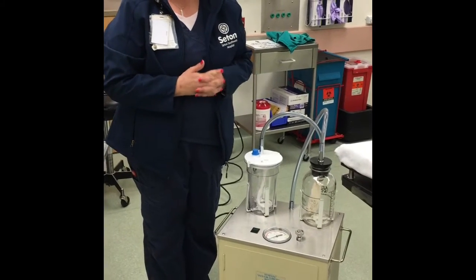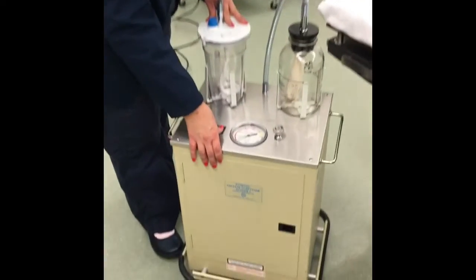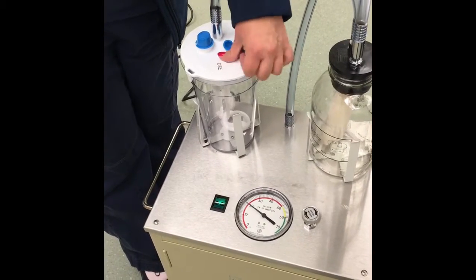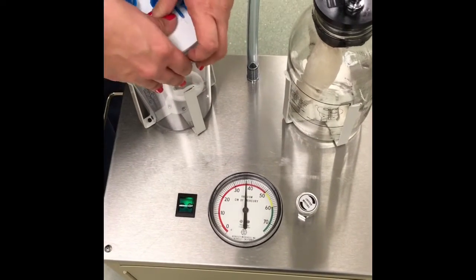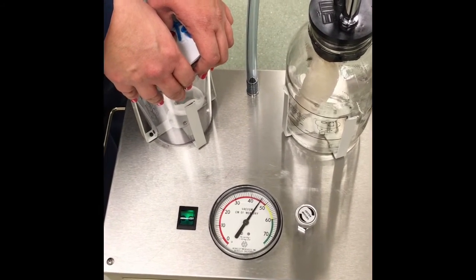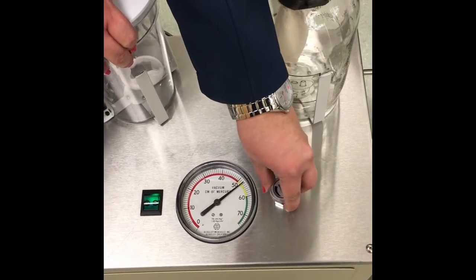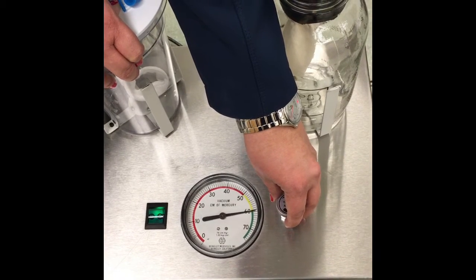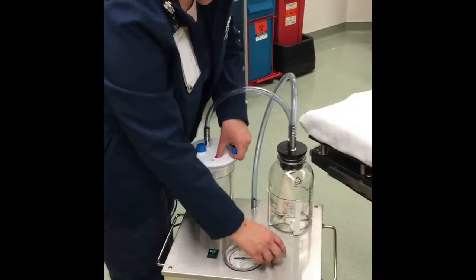The only thing you have to do during the procedure, the doctor will tell you when to turn the machine on. So you would turn the machine on, and it would be connected. I'm gonna see if I can get it up a little bit. It'll go to this section in here that's green when you have good suction. The only thing they might do is ask you to adjust, and sometimes you can just mess with this a little bit to get it to go up to the green area, and then it'll stay in that green area, and that's perfect. When they suck, it'll all of a sudden drop back down.